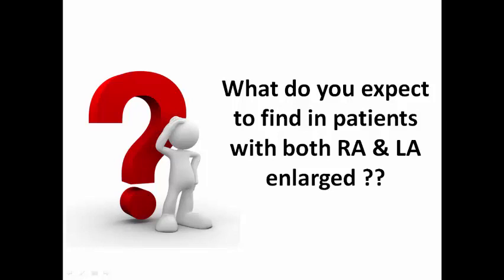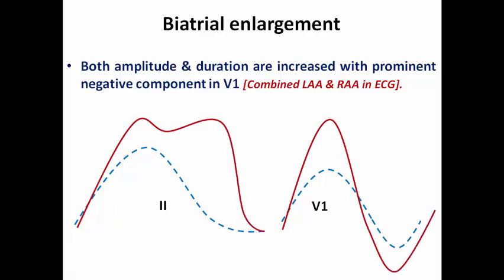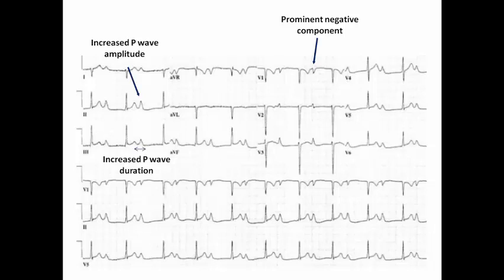What do we expect in patients with both right and left atrial enlargement? We expect both amplitude and duration to be increased, with a prominent negative component in V1. This is biatrial enlargement. In lead 2, both duration and amplitude are increased. In V1, duration is increased with a pronounced negative component, and the amplitude of the positive component is also increased. In this ECG example, P wave amplitude and duration are both increased in lead 2, and there is a prominent negative component in V1.